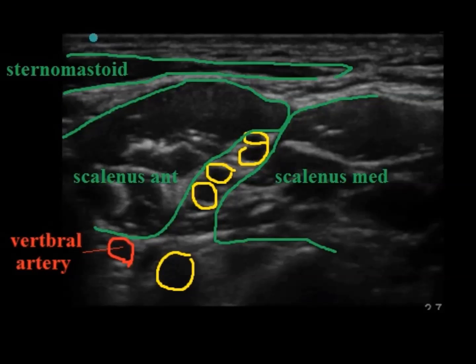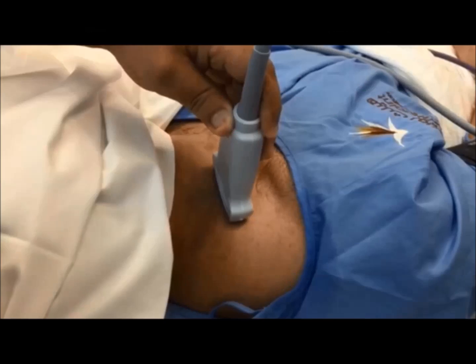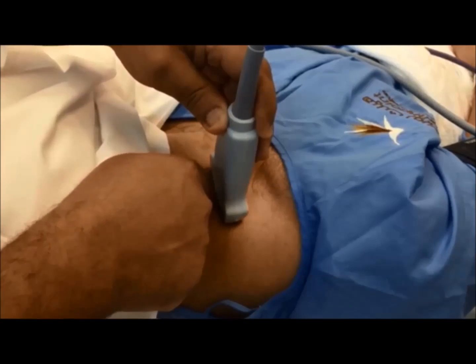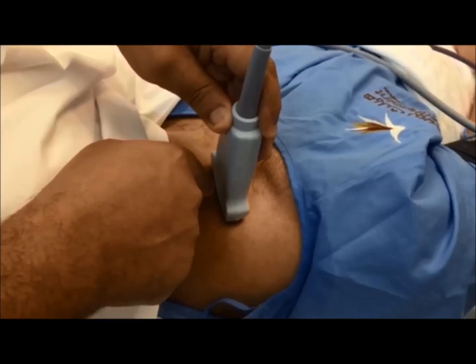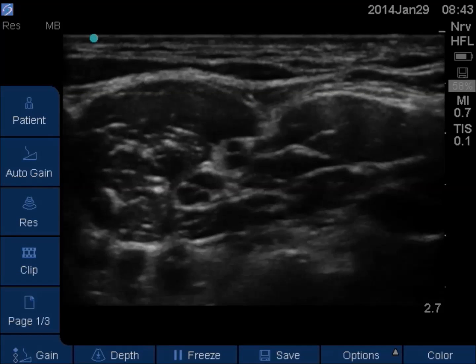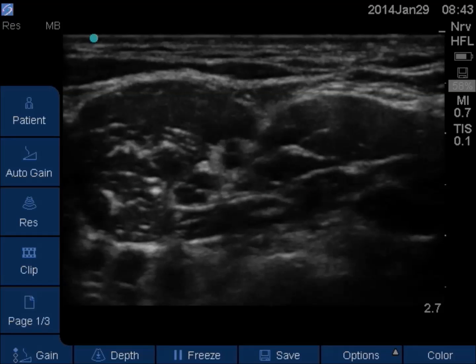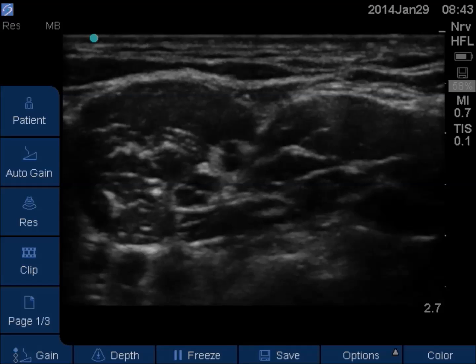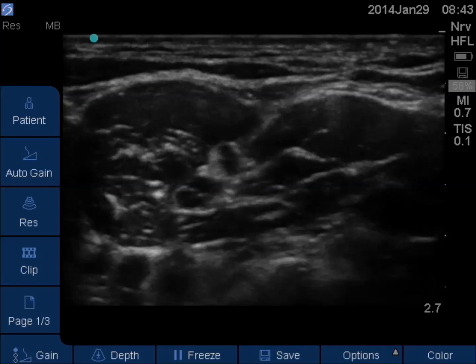It is important to identify the vertebral artery, which lies medial and posterior to the plexus. Advance the needle from this direction — this will be an out-of-plane technique. With good experience, the needle tip can be seen as clearly as in the in-plane technique.